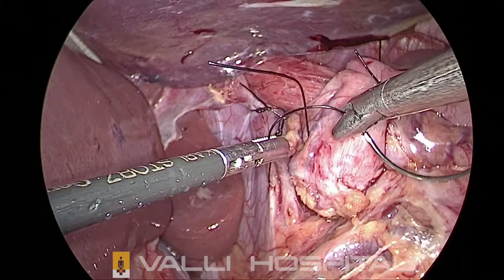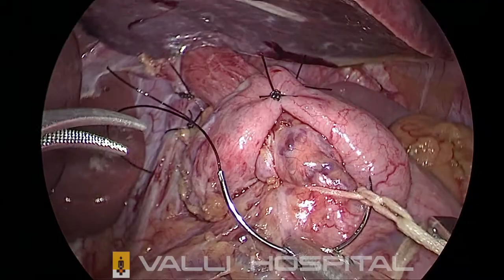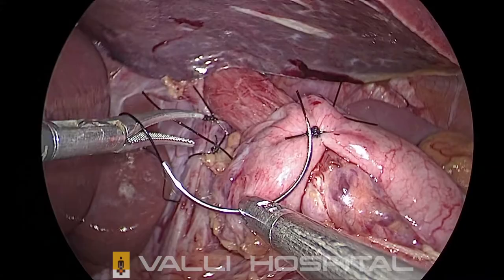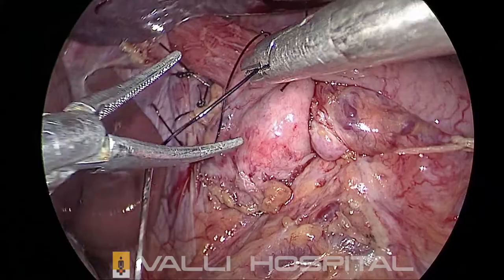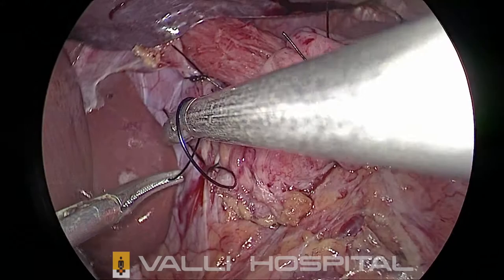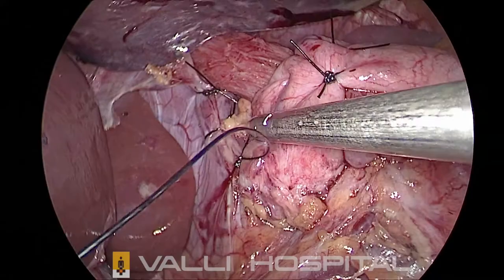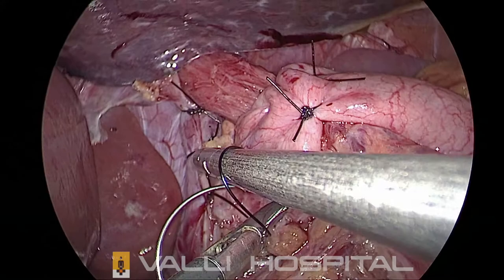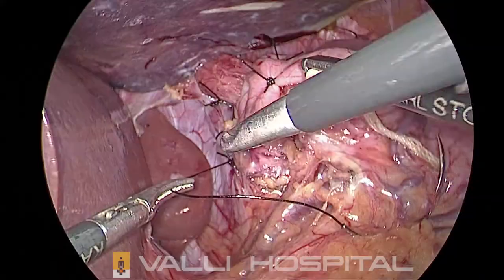The thread is very small, so it is better to use the Maryland to put the knots. If the thread is shorter, it's always better to use the Maryland. I am using a single knot. Surgeon's is better. You should not twist the stomach for this stitch. It has to lie comfortably there. That's important. There is a lot of mathematics in fundoplication that has to be strictly followed to have a good result.